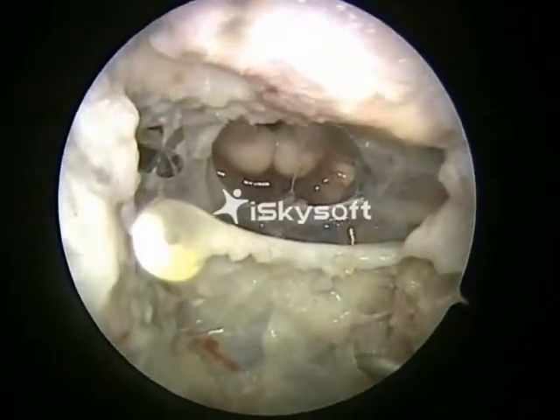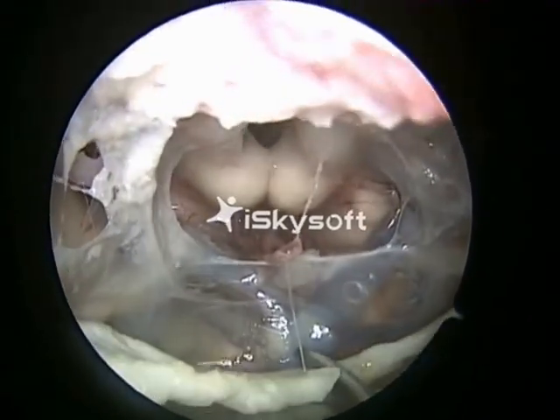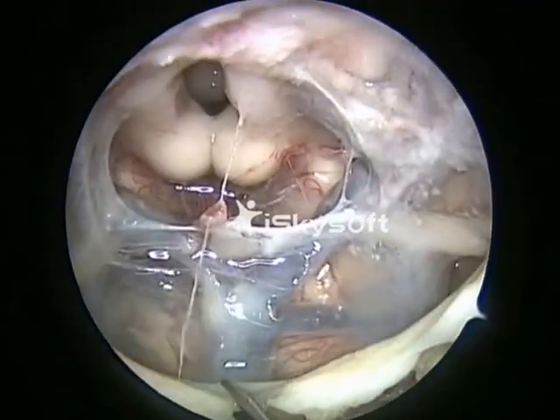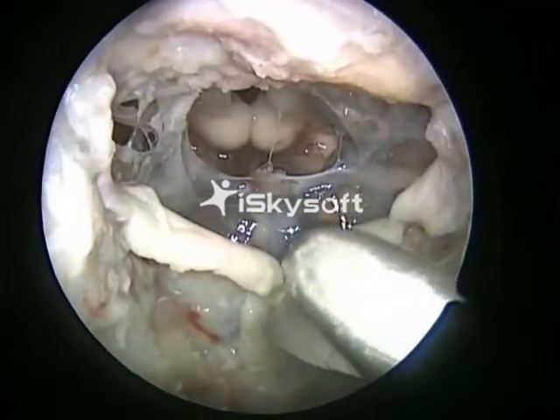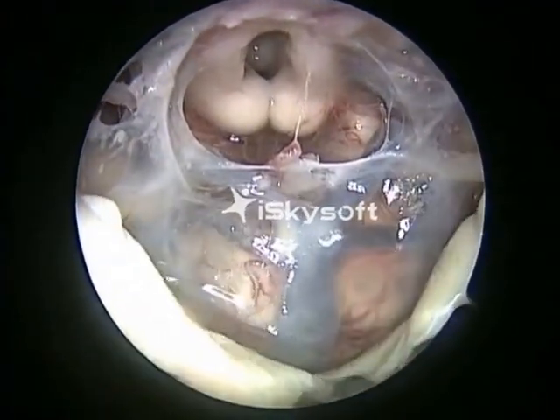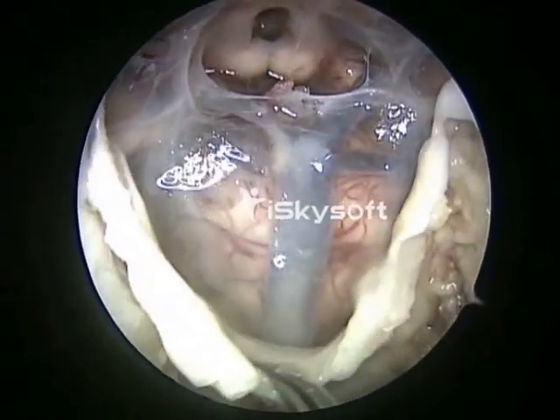Now we're using scissors, a down cutting scissors, and we start cutting the dura in the midline. We have to strictly adhere to the midline, because we should not damage the sixth nerve, which goes laterally.